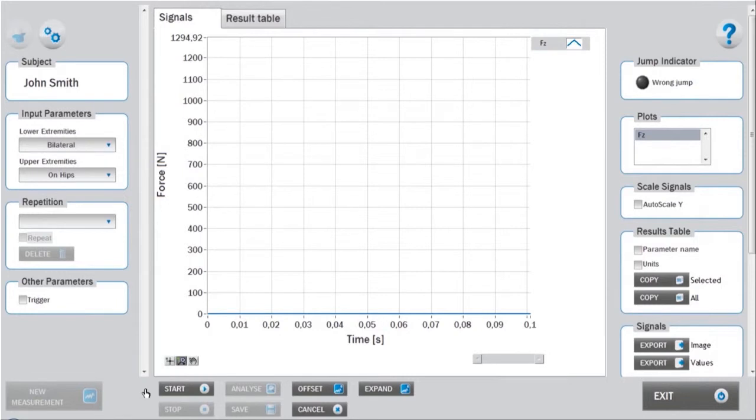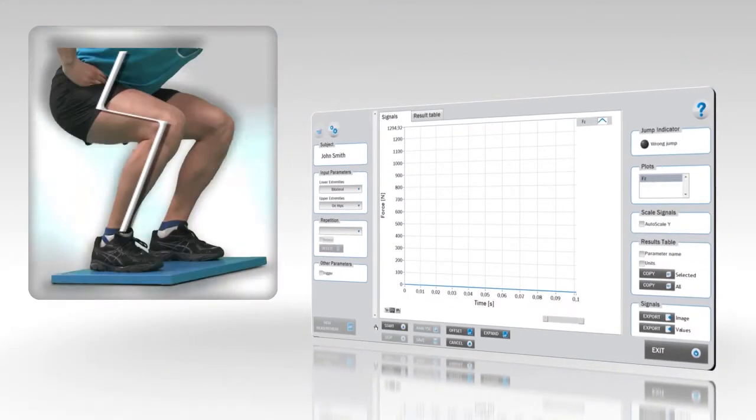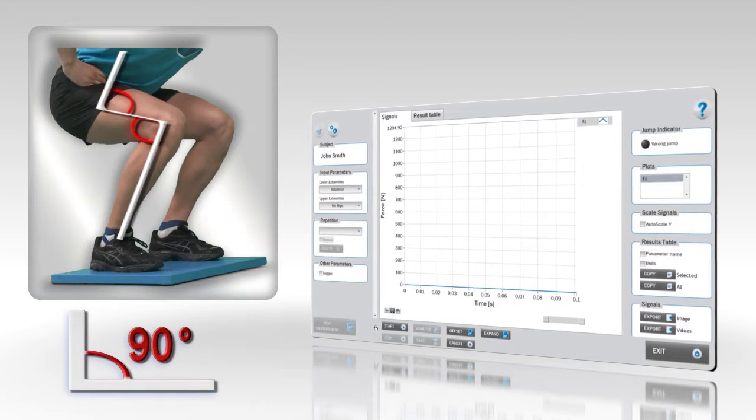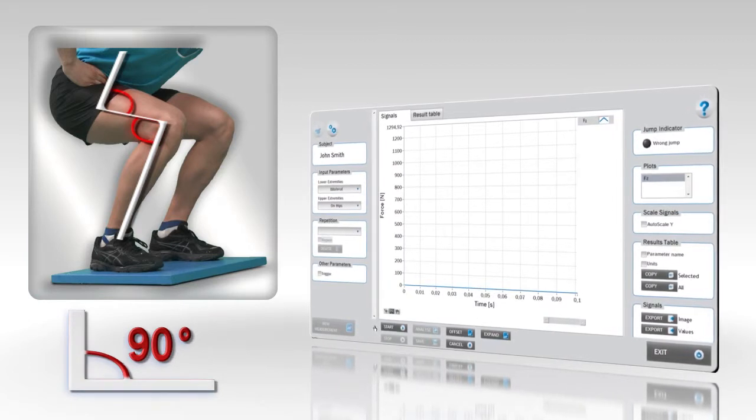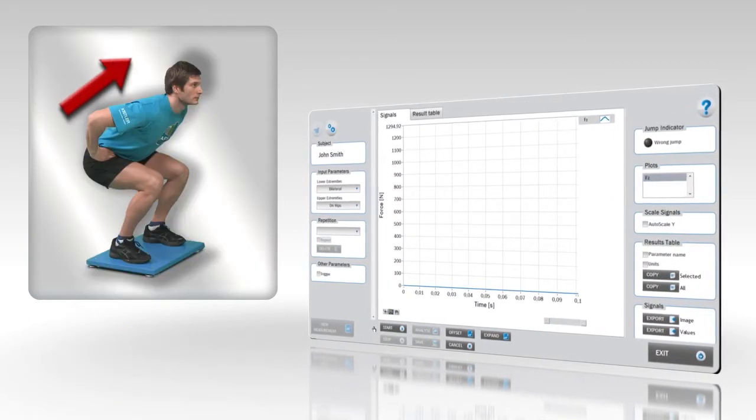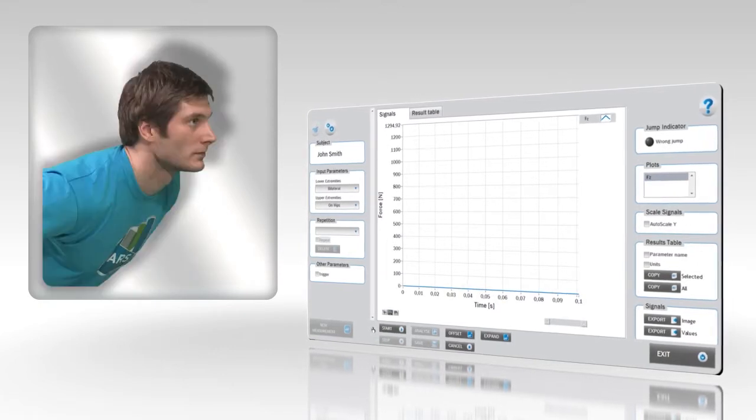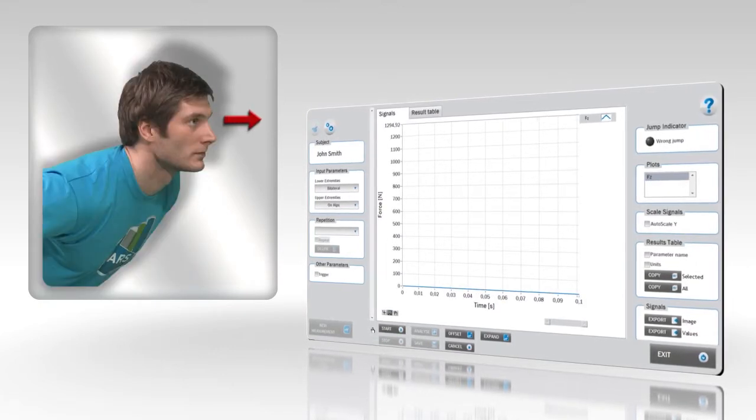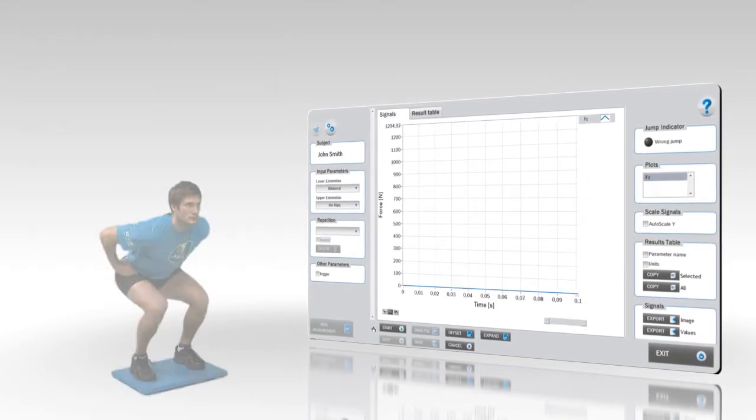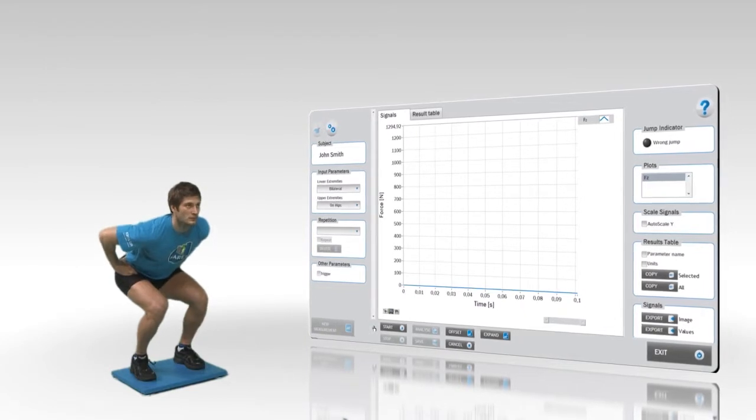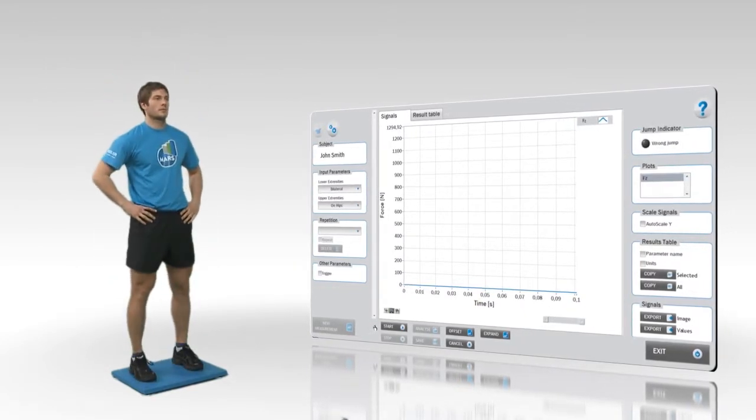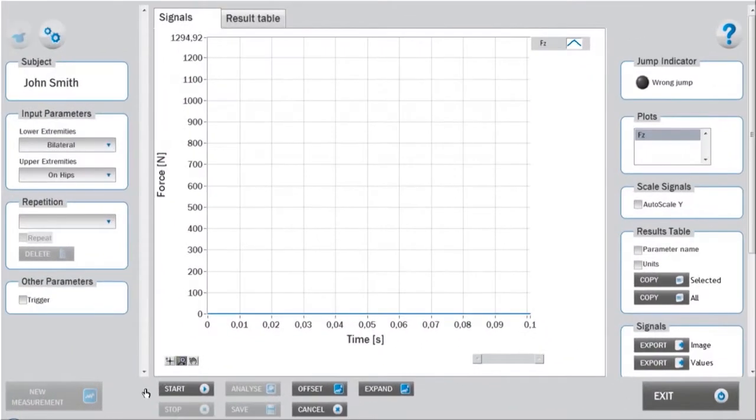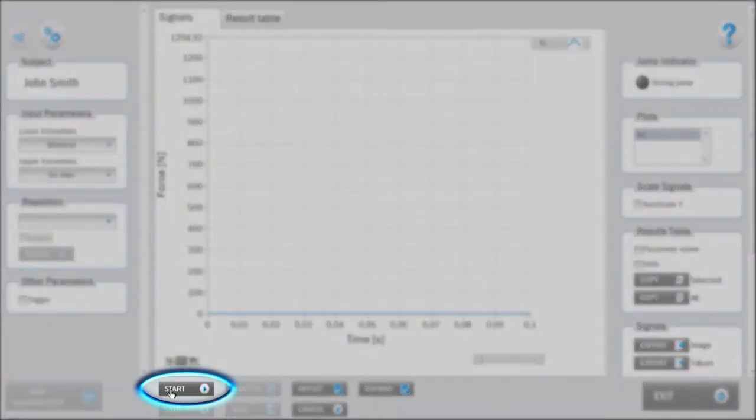Before starting the measurements, the subject has to assume an appropriate initial position, this being knees and hips flexed to 90 degrees, torso leaning slightly forward, and eyes directed to the front. The goal of the task is to produce an explosive vertical jump with no prior eccentric movement. Initiate the measurement by clicking the start button.